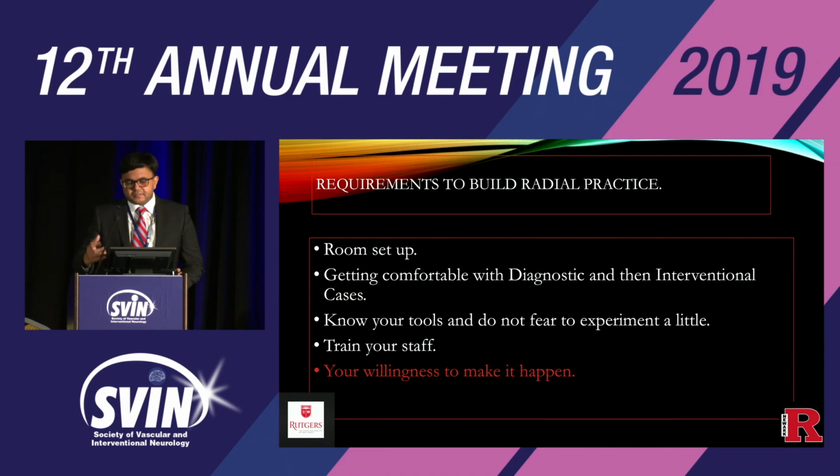So these are some of the tricks we use. You have to set up your room, again, the same way you set up your femoral. If it's different, you're likely not going to use it. Then again, start with diagnostic cases, then go on to interventional cases. You have to know your tools, and then you have to experiment a little bit. Train your staff, extremely important. You don't want a complaining fellow or complaining nurses saying, why are you making it harder for us? And then your willingness to make it happen.